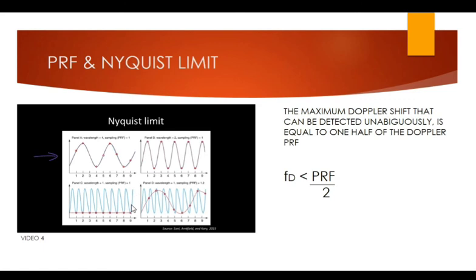And in contrast, in the bottom panels C and D, the wavelengths are sampled less than twice per wavelength. That is, the frequency of the wavelength is too high to allow them to be accurately interpreted by PW. So here the red wave, which is the machine interpretation, isn't accurate because the true ultrasound wave, in blue, isn't sampled frequently enough. The velocity of blood that generates these reflected sound waves therefore exceeded the Nyquist limit for these bottom panels.